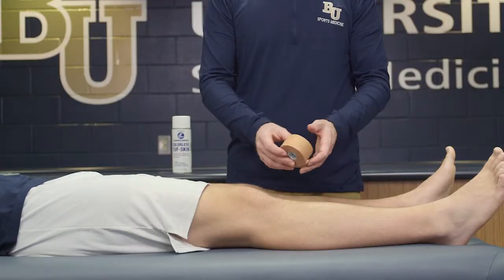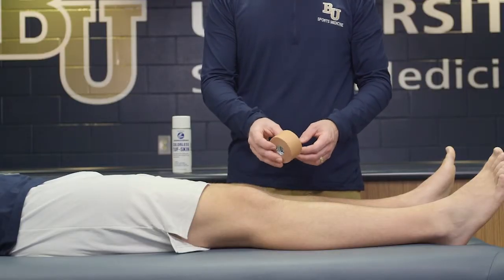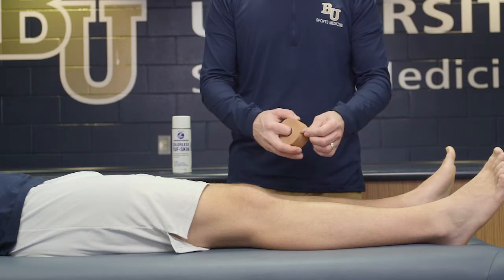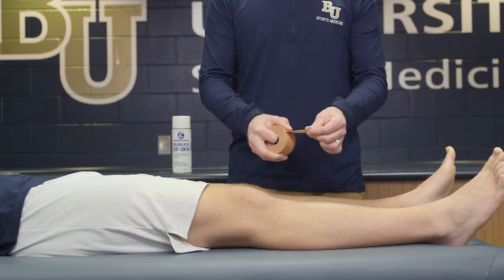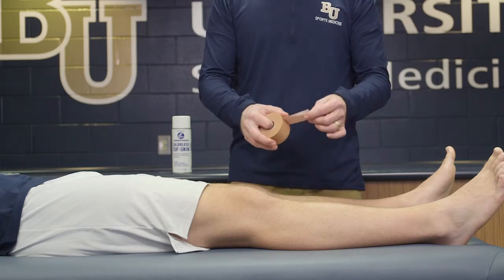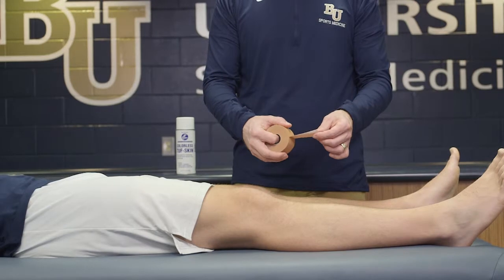What we're going to do is introduce a new type of tape which is called leukotape. This particular tape is a little bit different from our white linen in the fact that it doesn't stretch as much and has a little bit stronger adhesive, so it will secure onto the skin a little bit better.